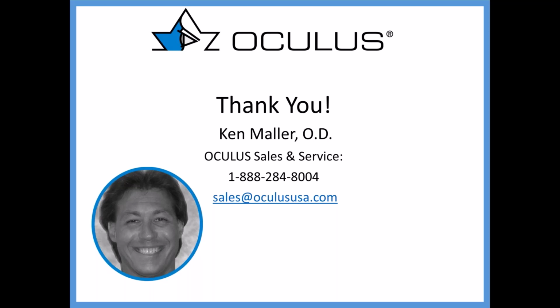I have countless numbers of lenses sitting in drawers collecting dust for probably close to 20 years now. I've really 100% abandoned trial lens fitting. I shouldn't say 100%, but it's 99 with a whole bunch of nines after that percentage. On a very rare occasion, I might reach for a lens just because I want to check something quickly. But for the most part, I really don't like to waste the patient's time or mine putting lenses on that don't fit well, for a couple of reasons.